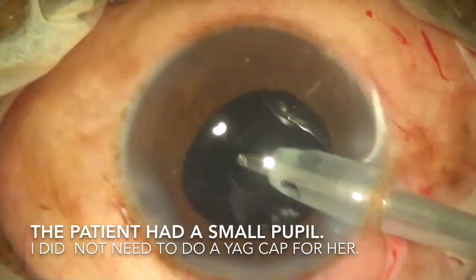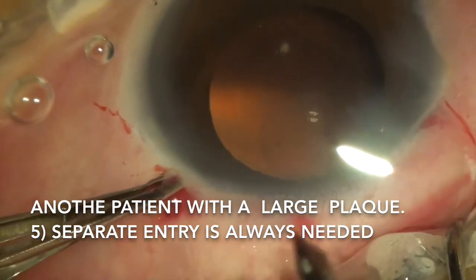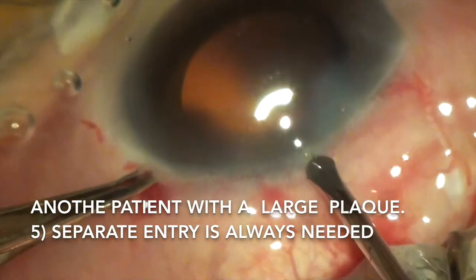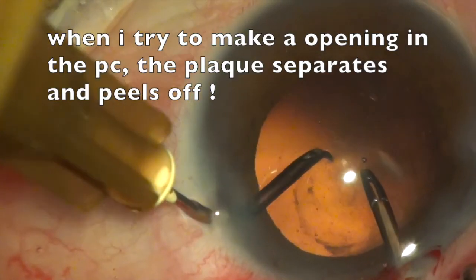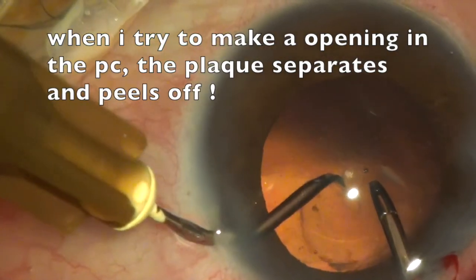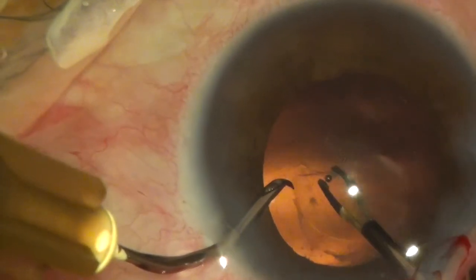This particular patient had a small pupil and had good vision after cataract surgery. Please remember: you have to make a separate entry. Do not use the main port and do not use the utrata forceps while doing a posterior capsulorhexis. When I tried to puncture the posterior capsule in this particular patient, I found that the plaque could be peeled off from the posterior capsule.